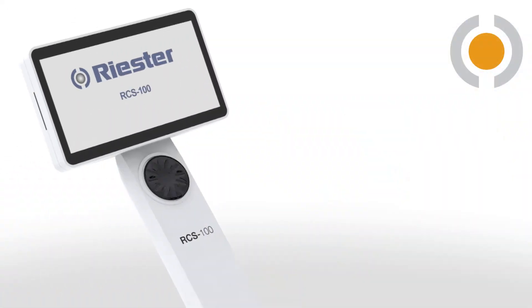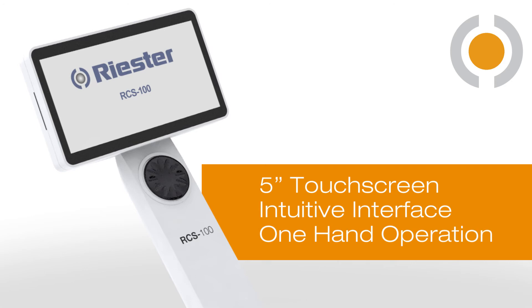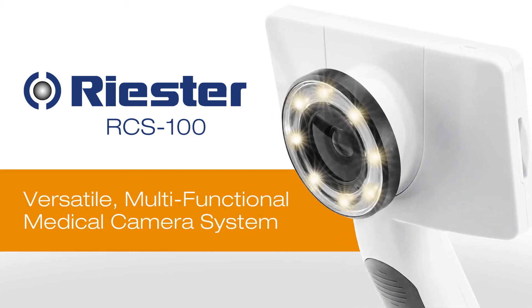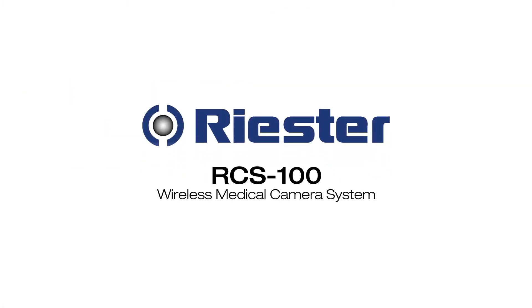While the visible white LED delivers accurate color. The large 5-inch touchscreen includes an intuitive interface with one-hand operation and an easy-to-use rotary wheel. The Li-Ion battery delivers 3.5 hours of operating time in video mode. The Riester RCS100 is a versatile, multifunctional medical camera system designed for your digital imaging needs.